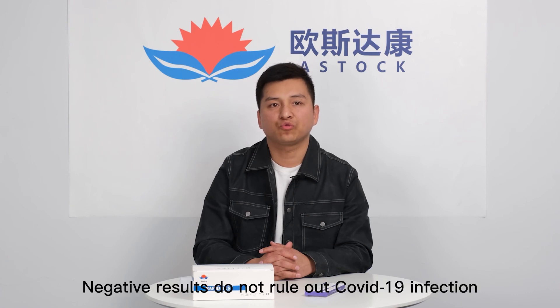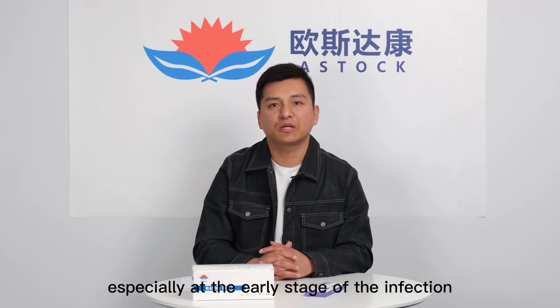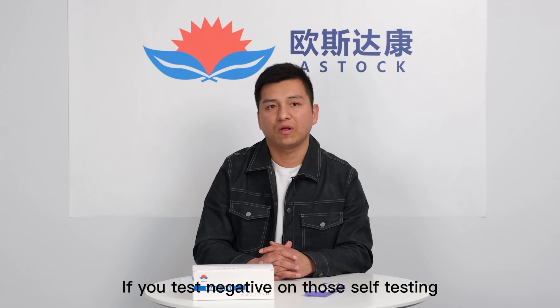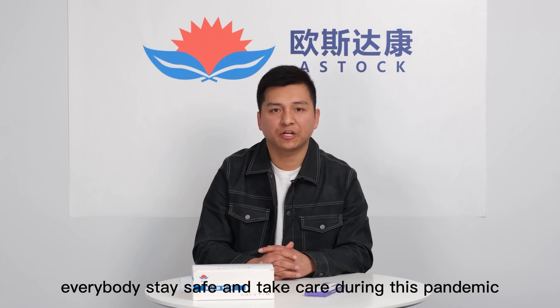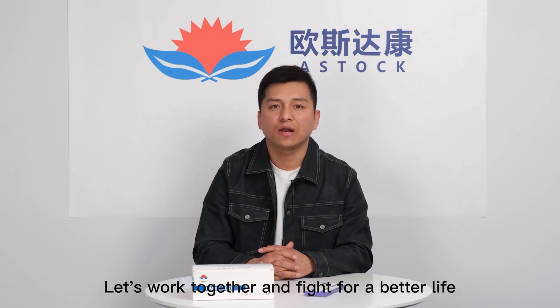Negative results do not rule out COVID-19 infection, especially at the early stage of infection. If you test negative on this self-test but still feel uncomfortable or sick, you should go to the hospital and see your doctor. I hope everybody stays safe and takes care during this pandemic. Let's work together and fight for a better life. Thank you.